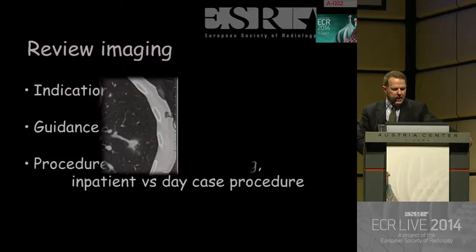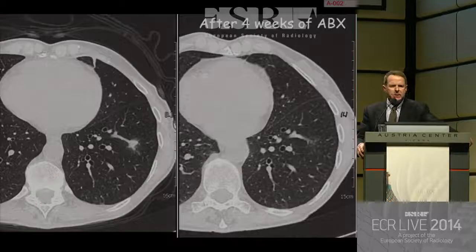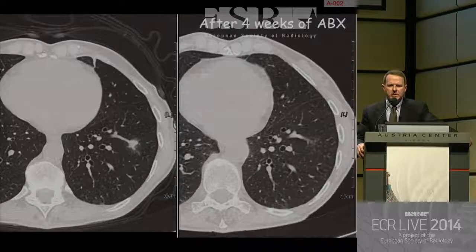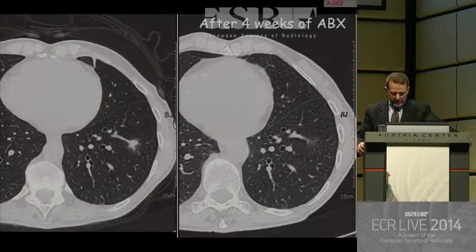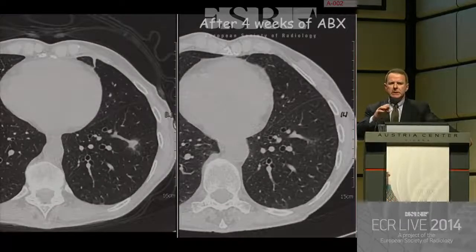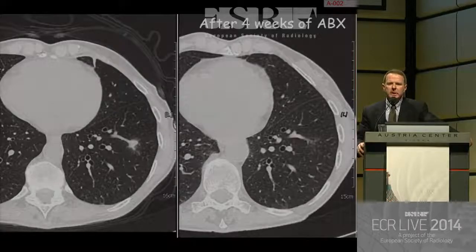And while you do that, sometimes you will realize that your biopsy is very, very easy because after 4 weeks of antibiotic therapy, that nodule is gone. And that nodule was a small pneumonia. How many times do we see that? We see that things that we wanted to biopsy and they were scheduled for biopsy are actually changing, okay? Most of the time you will see that the follow-up images are of poor quality because in the biopsy procedure we'll use a low-dose setting, so the quality of the lung windows is noisy, so you will notice that.